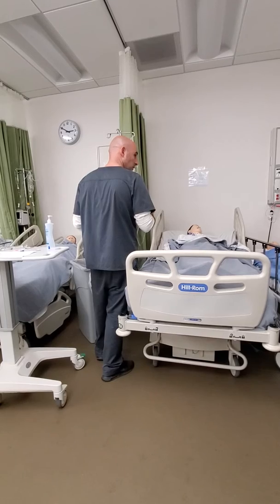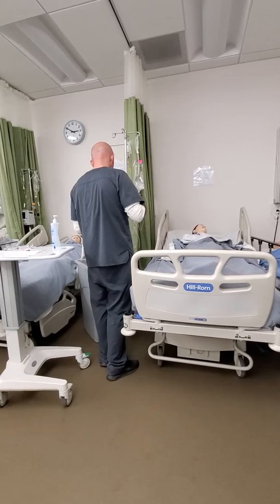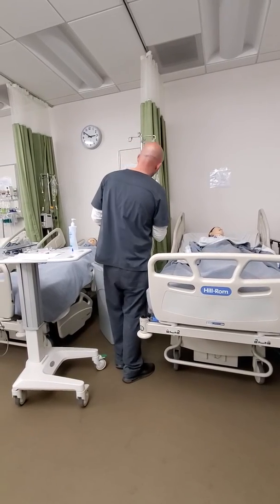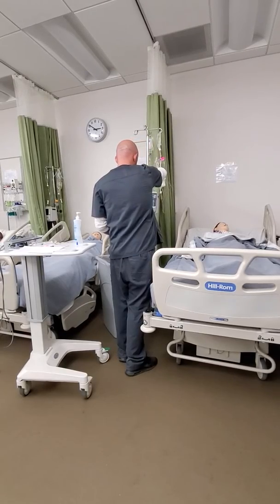No, but it's good to troubleshoot, so how are you gonna get rid of that? You did see air there. Yeah, so I'm gonna open up this clamp and nothing flows. Why? Nothing flows because there's a kink in this.